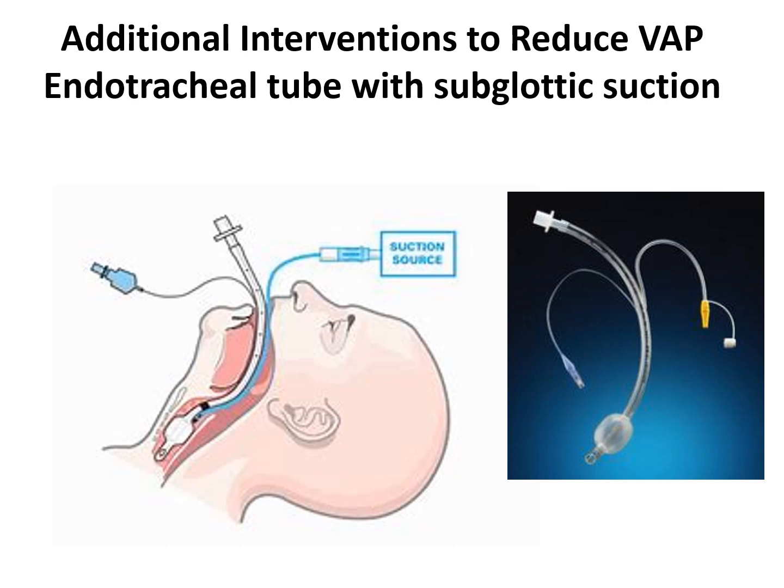Additional ways to reduce VAP is having an endotracheal tube with a subglottic suction. Not all endotracheal tubes have it, but what it does is allow a little area at the base, at the top of the balloon, that comes out and goes to a suction source, and it'll take all the secretions that can accumulate there. Now, the patient's endotracheal cuff, even though it's pretty tight against the airway, if the patient turns their head or anything, secretions can flow down past the endotracheal tube and go down into the lungs. So getting rid of those secretions routinely will help eliminate that problem.